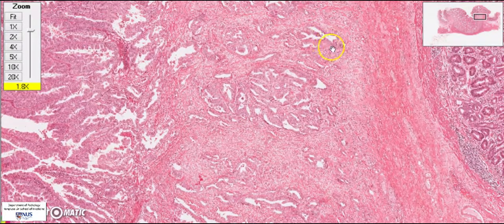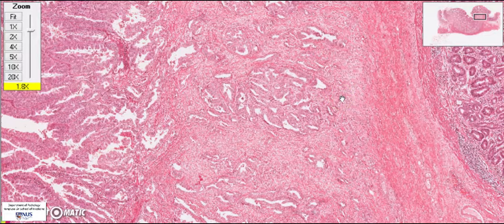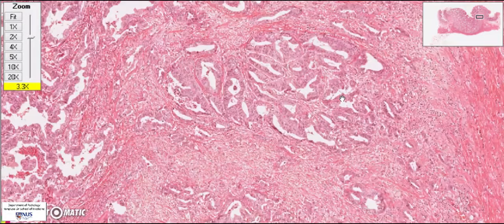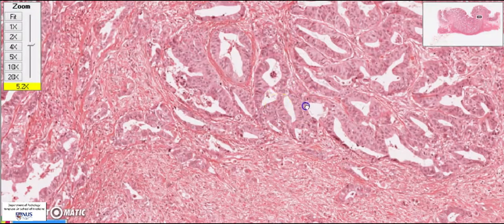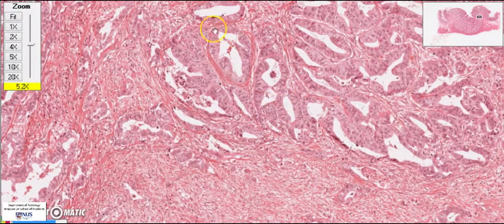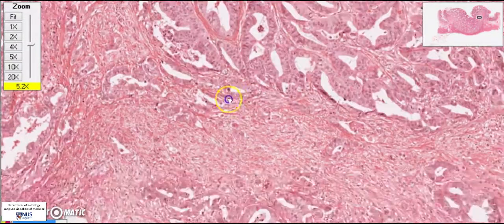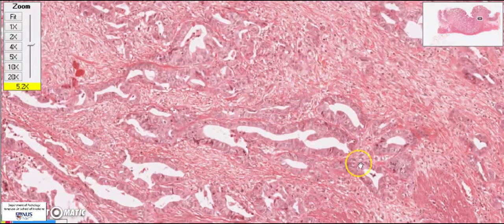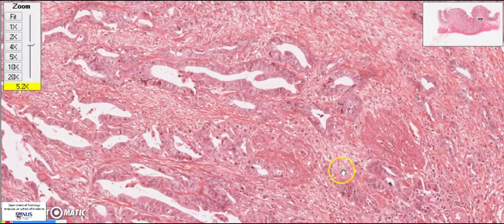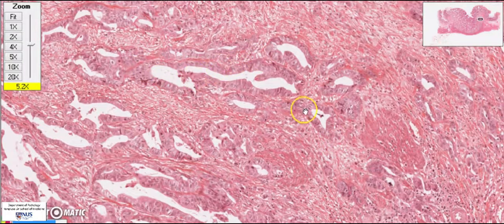As you can see, this is clearly gland-forming. We don't really have a component of the diffuse type with a single cell infiltration pattern. So since this is largely gland-forming, this would fall into the intestinal type.